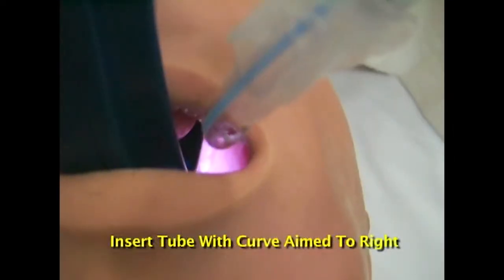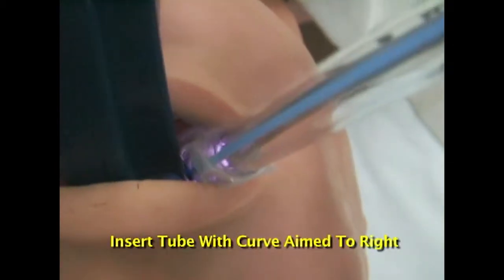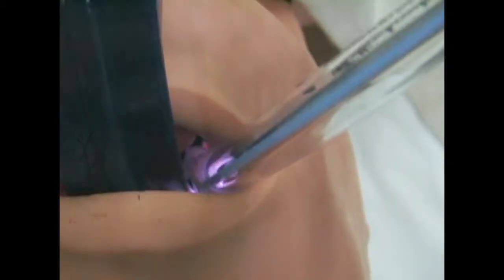Once inside the mouth, optimally position the image of the larynx in the midline. Don't insert the GlideScope too deep. Insert the endotracheal tube under direct vision, with the curve aimed toward the right side of the mouth. This keeps the tip from tangling with the blade.